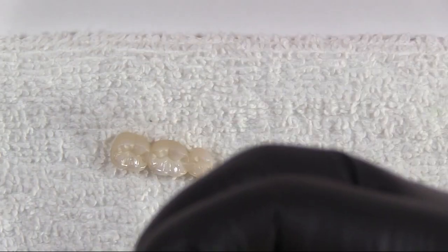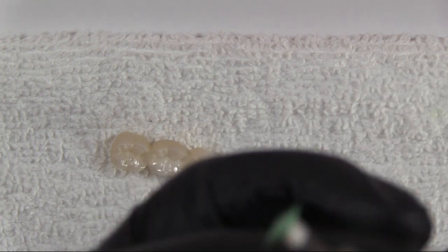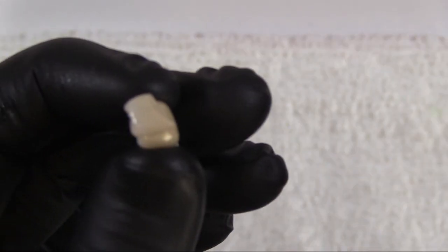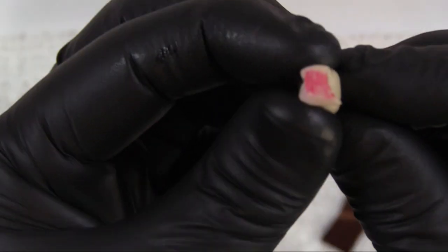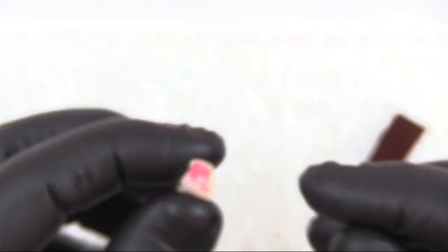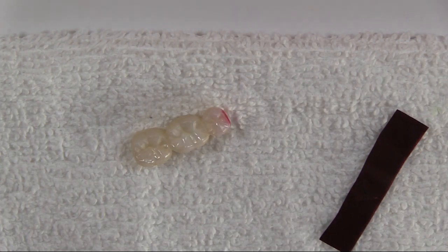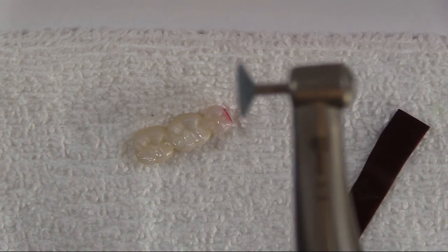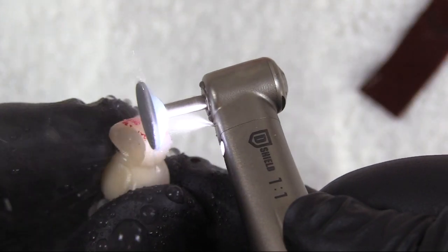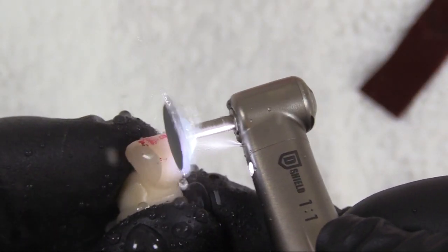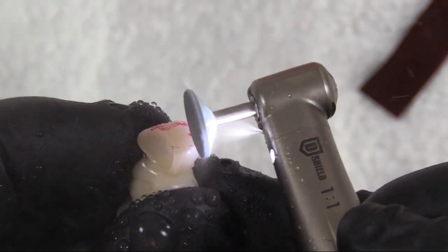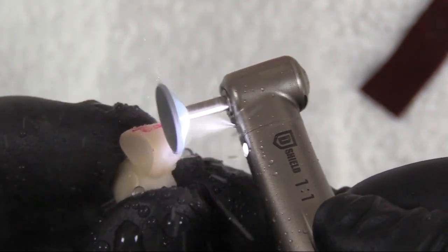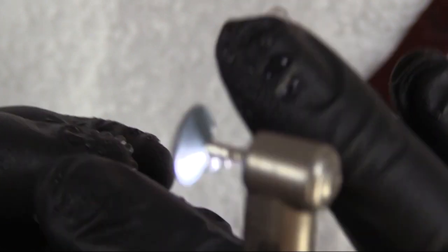Once that's done, you can increase the polish and remove any roughness with the subsequent steps of the green polisher and then the orange polisher. If we had a very heavy contact interproximally, we would start with the blue rubber diamond impregnated polisher. As you see, the water is cooling the zirconia as well as the burr as we are adjusting the interproximal contact.